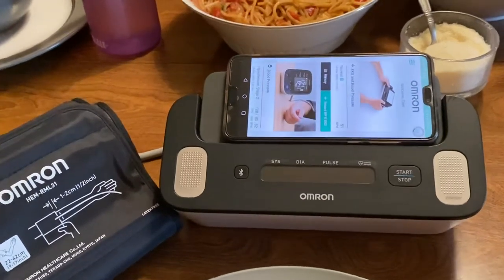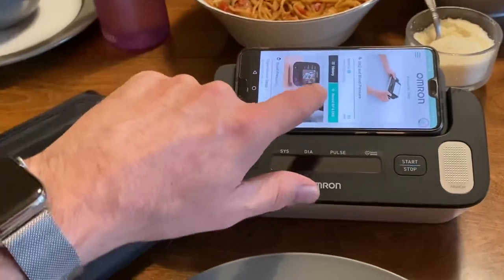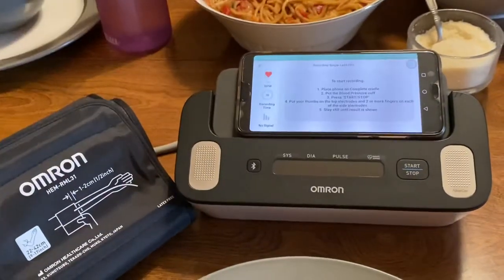I wanted to show you how easy it is to take a reading. I have my smartphone in the device and I have the Omron app open and I simply tap the button that says I want to take a reading.